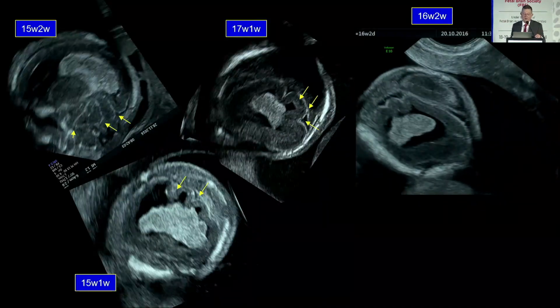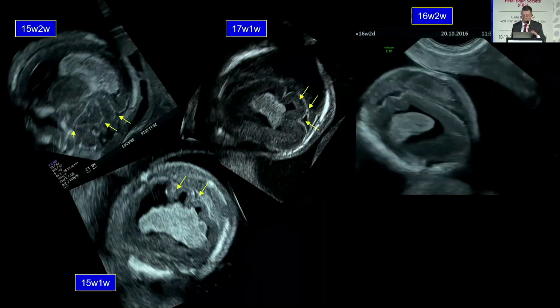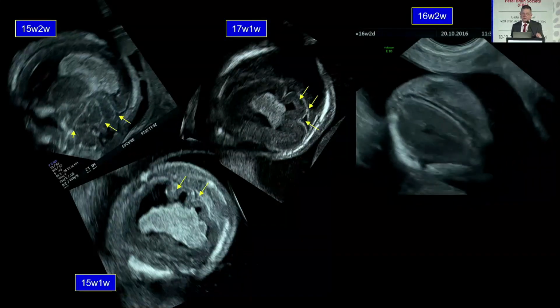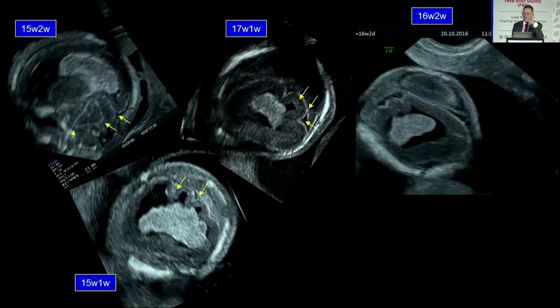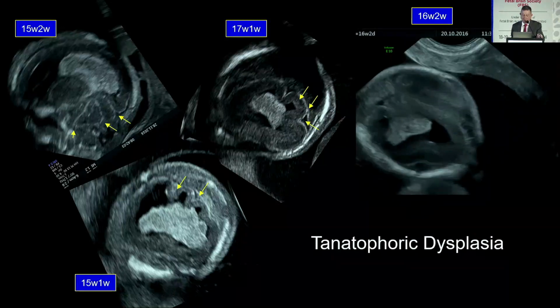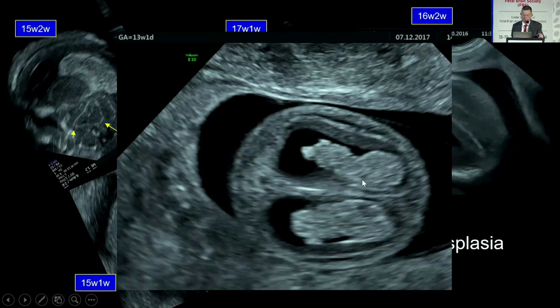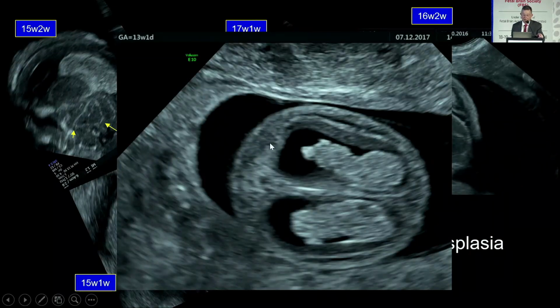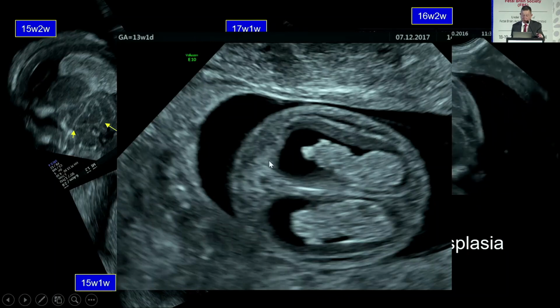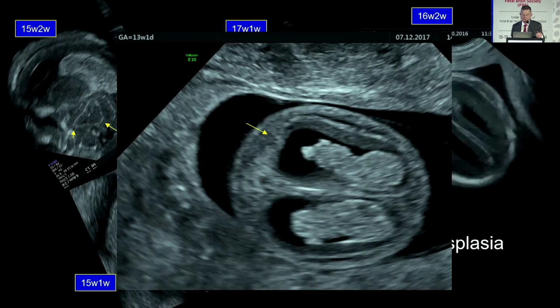So, but look at the brain, because this makes the diagnosis of the FGFR3 type of malformations. They are not pathognomonic of thanatophoric dysplasia. Also, someone told you that they can be associated with other skeletal dysplasias. Now, it's possible to see that early in pregnancy. Here you see we can see a fetus at 13 weeks, and you see here that this zone, the lamination is completely abnormal, so it can be suspected, but the pathological sulci are not yet clearly demonstrated at this gestational age.